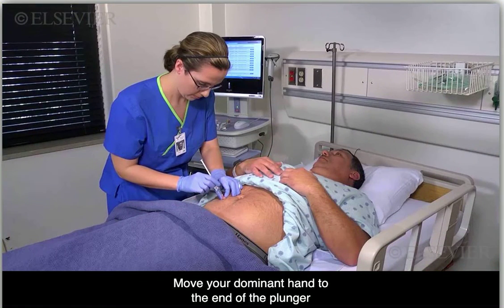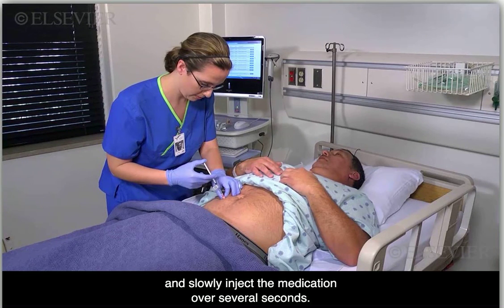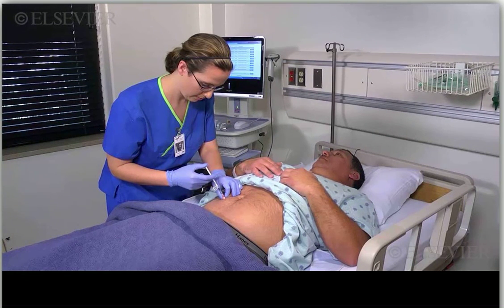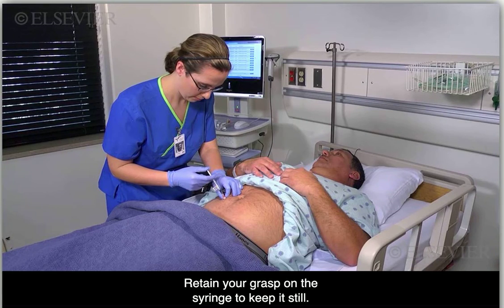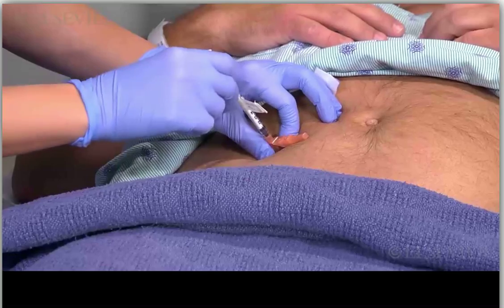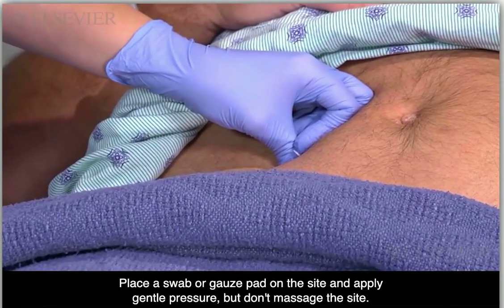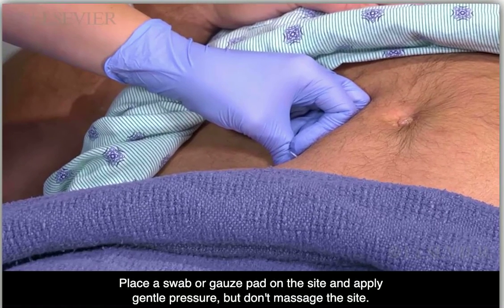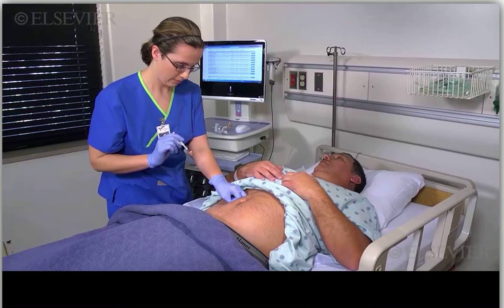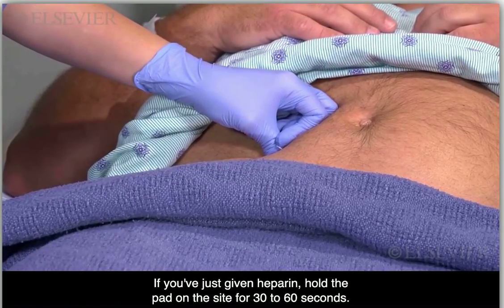Move your dominant hand to the end of the plunger and slowly inject the medication over several seconds. Retain your grasp on the syringe to keep it still. Quickly withdraw the needle. Place a swab or gauze pad on the site and apply gentle pressure. But don't massage the site. If you've just given heparin, hold the pad on the site for 30 to 60 seconds.